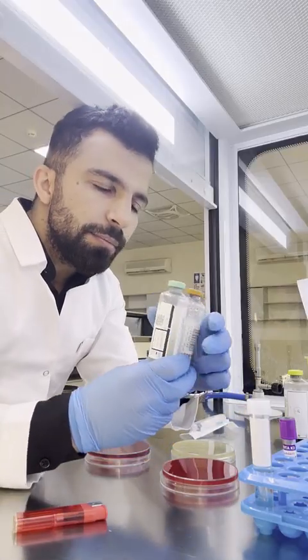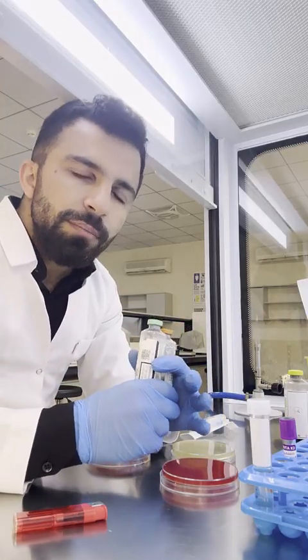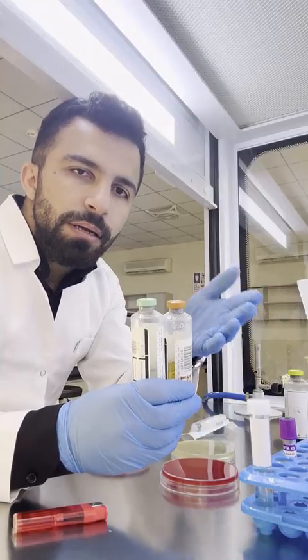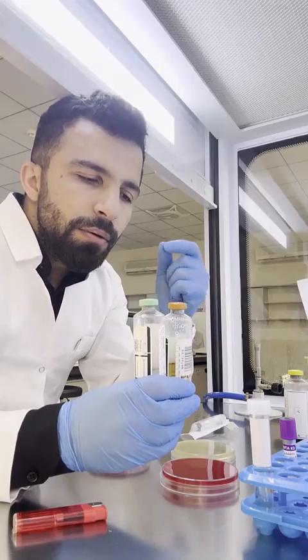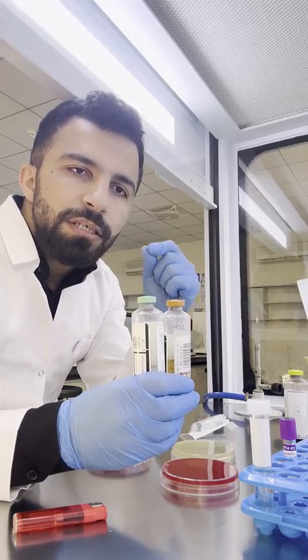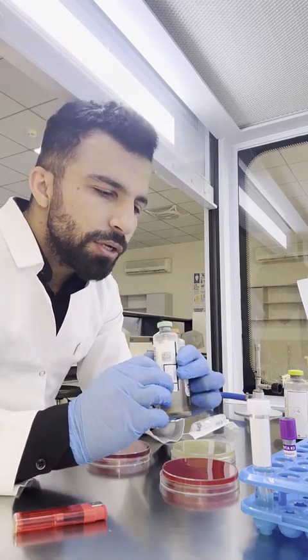And we put them into an automated analyzer, which keeps alert for 5 to 6 days, because sometimes in blood there could be fungi or bacteria. When we get a positive alert that bacteria is present inside the blood, then we are going to culture it.